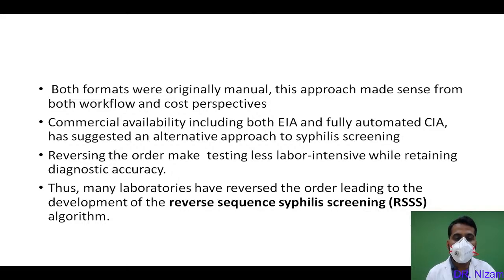But with the commercial availability of the automated system, they have now shifted to the reverse algorithm. Both the formats were originally manual. This approach made sense from both the workflow and the cost perspective. Then commercial availability, including both EIA and fully automated CIA, has suggested an alternative approach to syphilis screening.